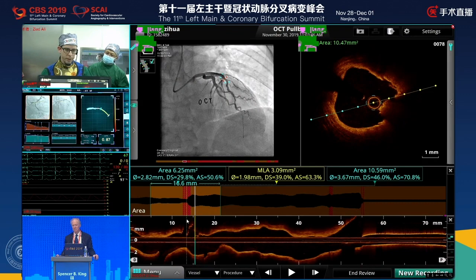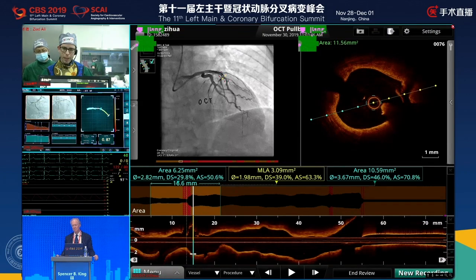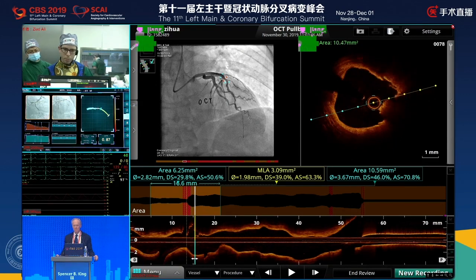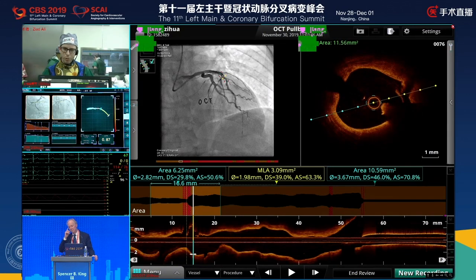This is the septal branch we have down here. And we can see, just proximal to the septal branch, we do have a protruding calcified nodule and also maybe a small plaque rupture or a scratch in the surface here in a lipid plaque, just here behind that. This calcified nodule also looks a bit acute with a bit of irregular surface, indicating some thrombus.